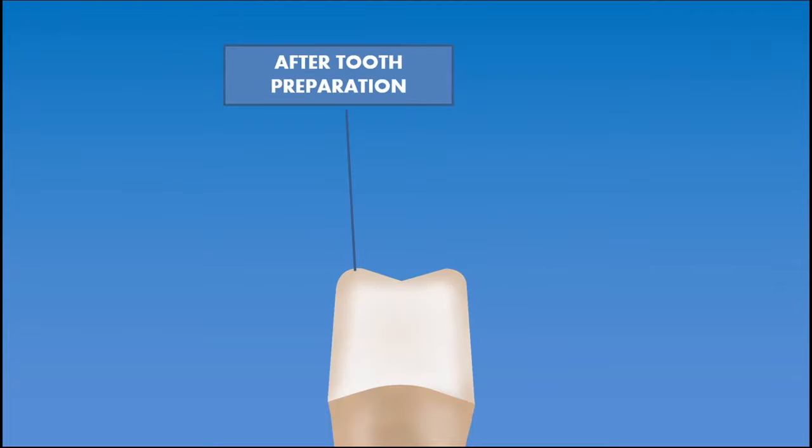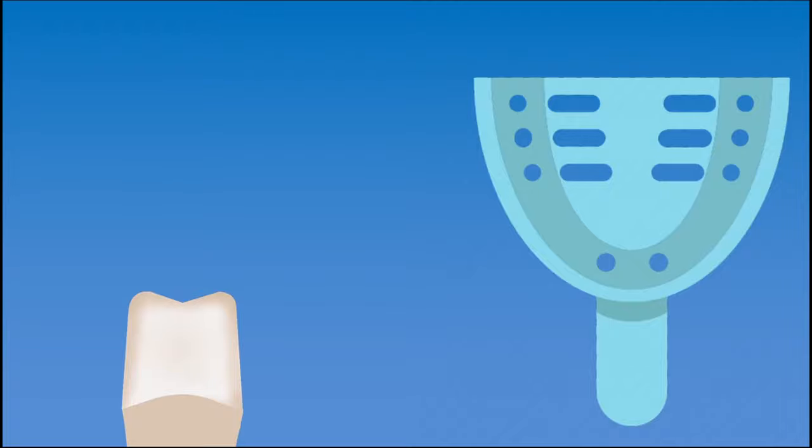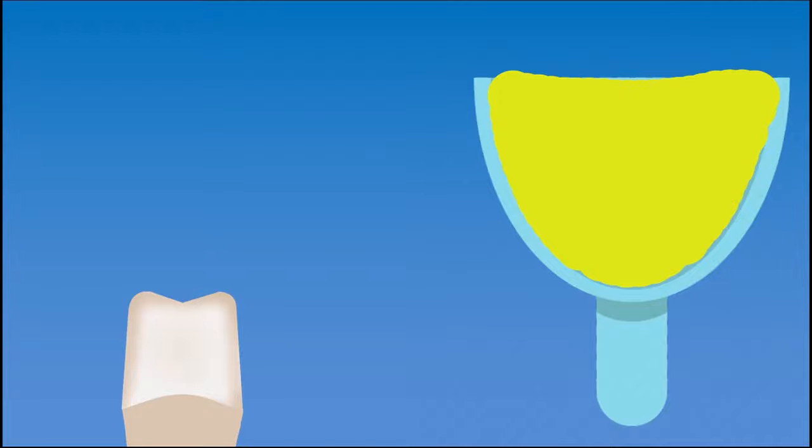The first step is to do the tooth preparation so that the tooth can receive a crown. All the fundamental principles of tooth preparation should be followed. Once the tooth preparation is complete, an impression tray is selected which fits the arch size of the patient's jaw. Once the tray is selected, impression material is loaded in the impression tray, then it is placed over the prepared tooth in the patient's mouth to obtain an impression. Die stone is mixed and poured without any air entrapment to get a replica of the prepared tooth. This is called a die.